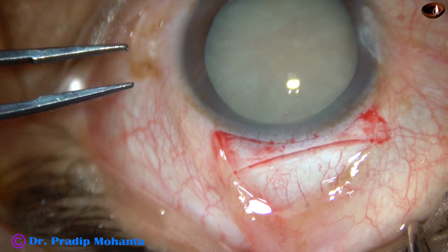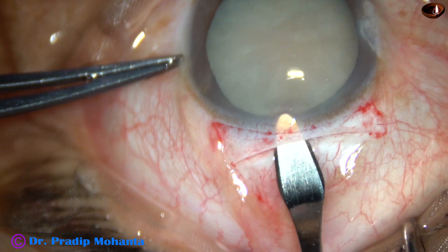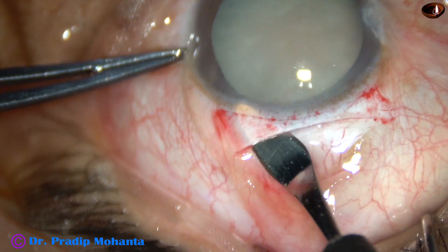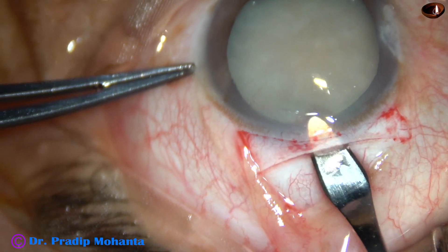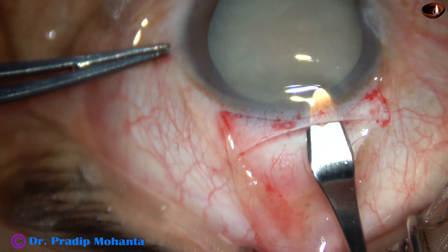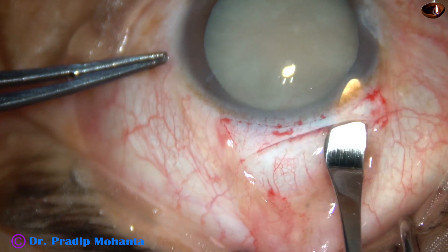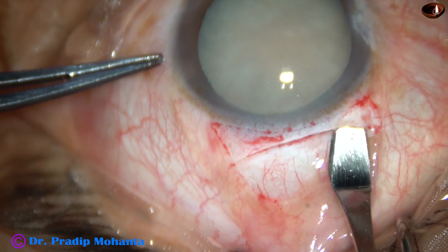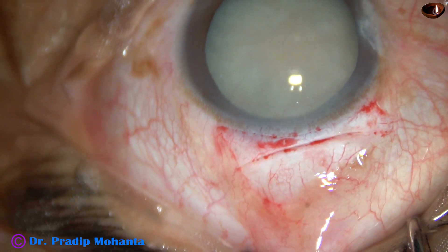And now, see how the tunnel is done. Go into the clear cornea and sweep backward and to the left for making the tunnel from center to the left side. This creates a little larger opening inside because of that maneuver. Then sweep backward and to the right and you have got a very nice sclerocorneal tunnel with a very good corneal valve.